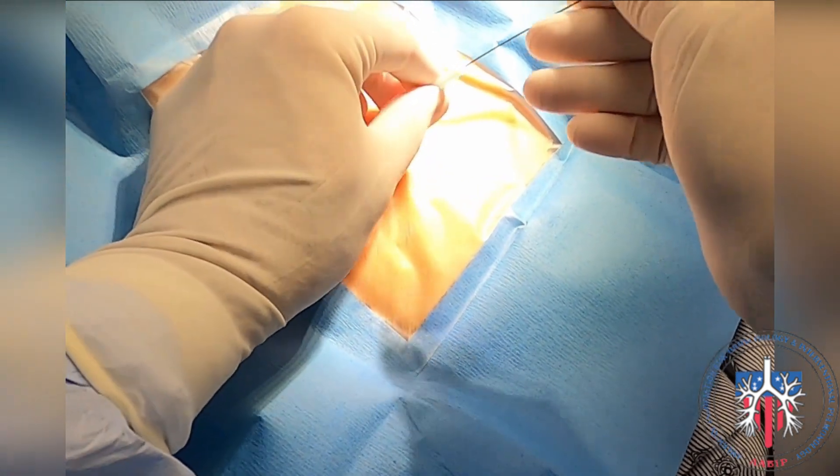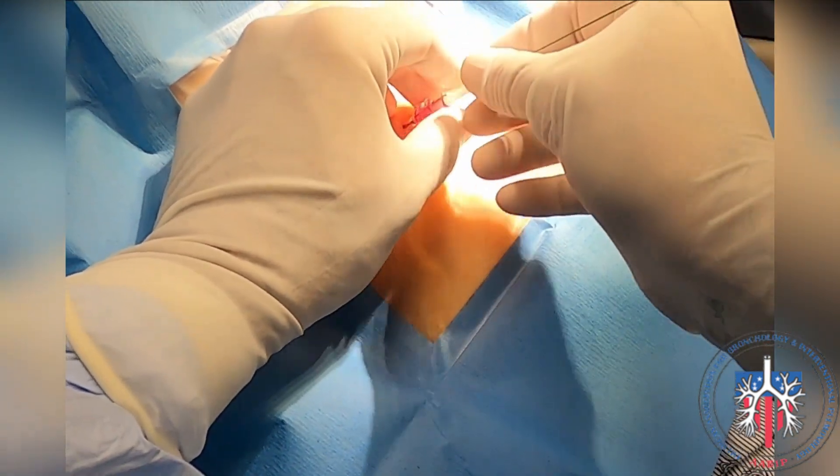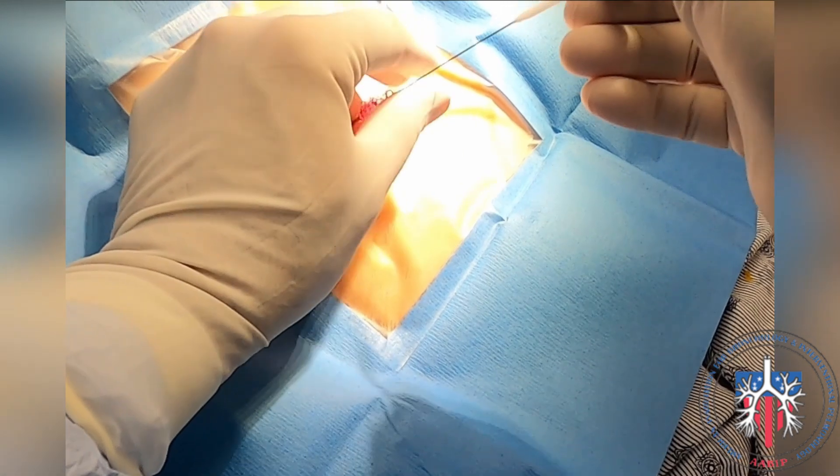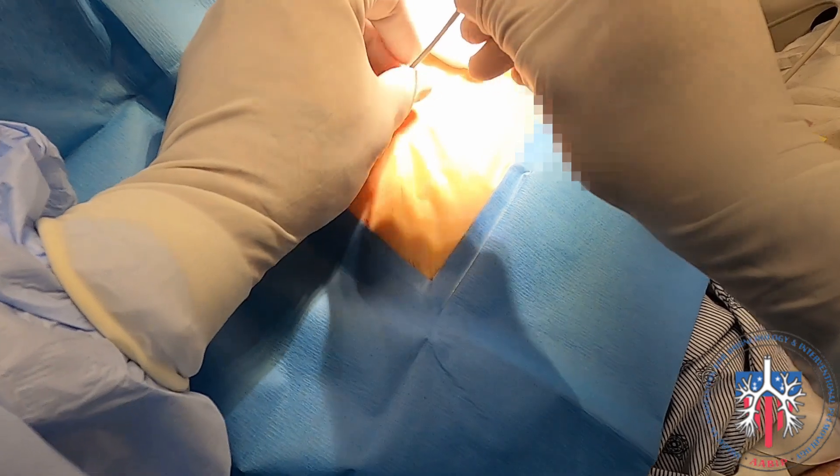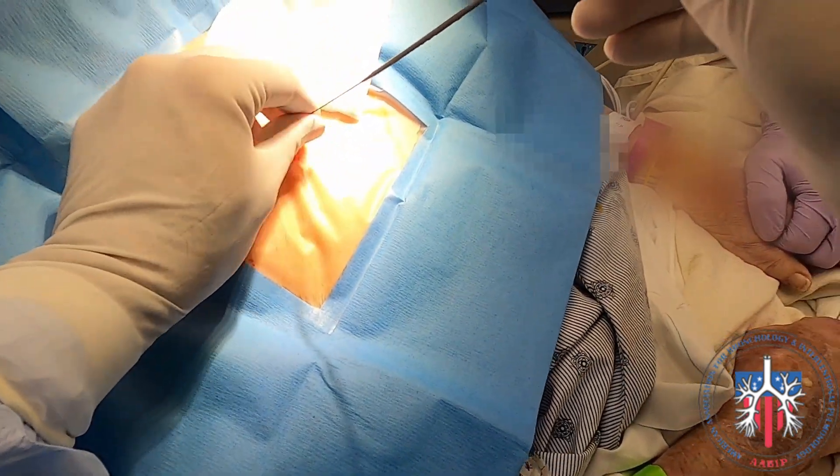The guide wire is passed through the introducer needle into the pleural space, and then the needle is retracted. We dilate the track with the provided dilator.